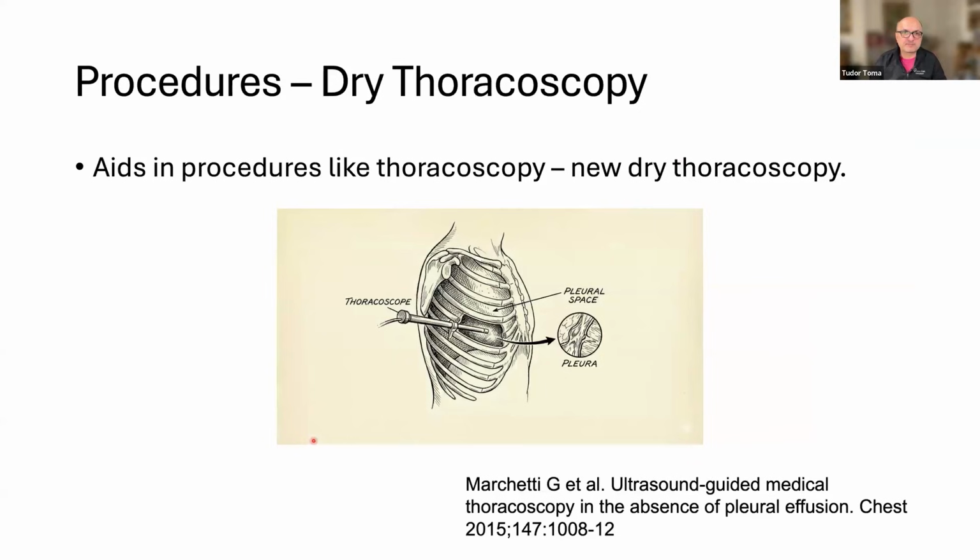with the procedures. An interesting development, if you want, with the use of ultrasound is the dry thoracoscopy. And you may know that Dr. Marchetti from Brescia is one of the promoters of this newly discovered technology. I mean, people in the past were doing dry thoracoscopy, but it wasn't very safe.